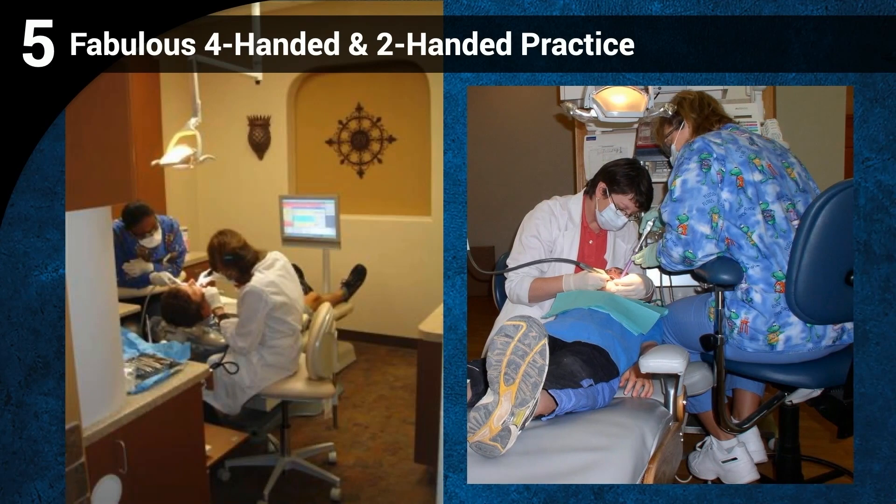The result of that, too often, is horrible posture and wanting to have another job — and that's what we're trying to prevent. That's not four-handed dentistry; it's really three-handed dentistry — one arm is hanging on to the hook and the other arm is kind of useful for sucking spit. I want to be able to pay people more, but if I'm paying people more I need them to be more productive, and that means getting them closer to the field. As they get closer, they can get rid of the belly bar and have better posture.